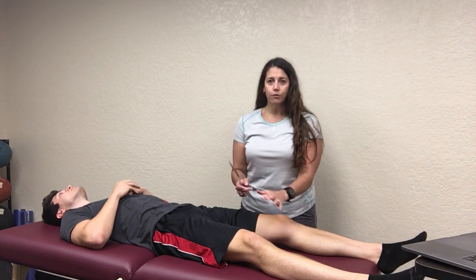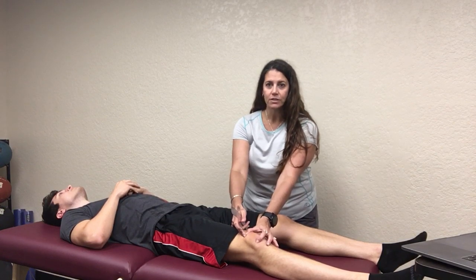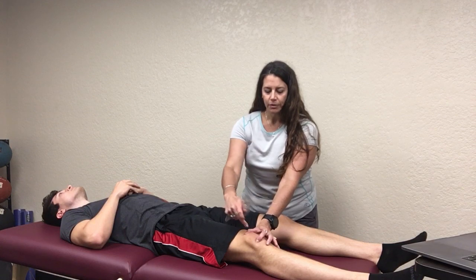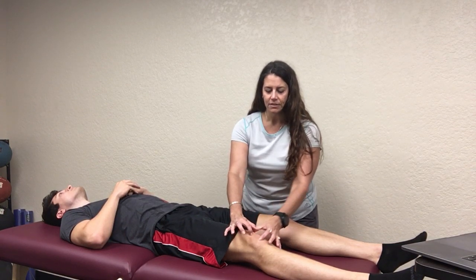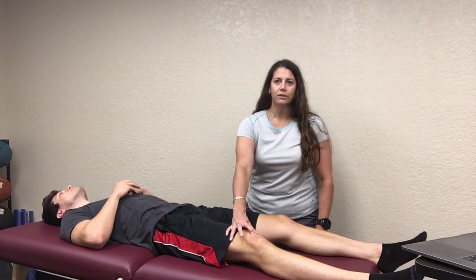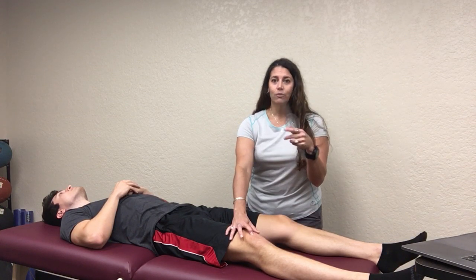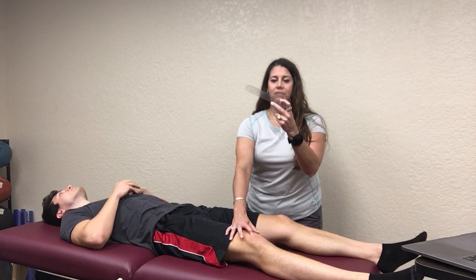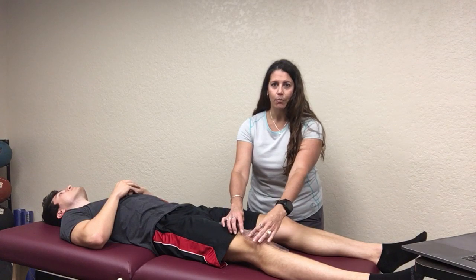So the very first thing that you're going to do when you're looking for the Q angle to measure it is you're going to look at the patella, superior to inferior, and find the middle, and then also medial to lateral and find the center of it. And a lot of times people just put a dot there so that way it's consistent. And then you're going to take your goniometer and take the fulcrum or the axis of it and put it exactly on that point.